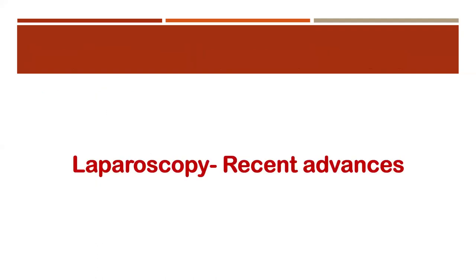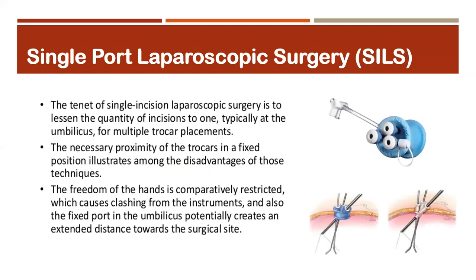The other thing is the recent advancement in the laparoscopic surgical age. Initially, I can give an example of laparoscopic cholecystectomy. Generally, we perform laparoscopic cholecystectomy with 4 ports or 3 ports, depending on the surgeon. But some enthusiastic researchers developed single-port laparoscopic surgery, also known as SILS.